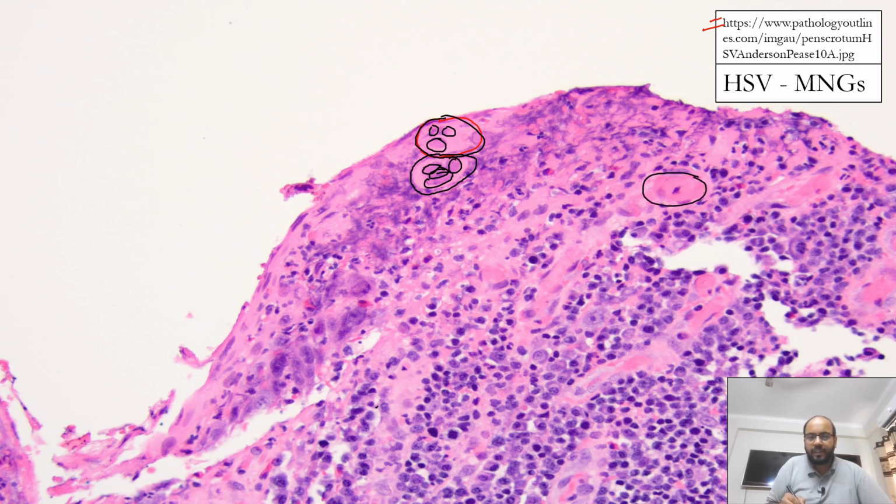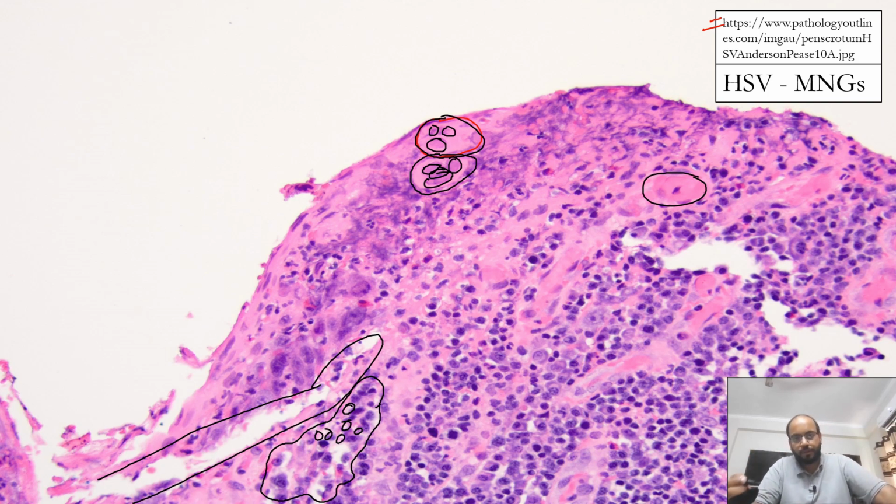A little bit of ballooning degeneration is observed here. Can you see a spongiosis-like picture? It is showing some localized spongiosis. And when you look closely, you see that some of the cells have empty spaces in between because they are undergoing ballooning degeneration. And if the degeneration is vast, it will lead to a split like this, an intra-epidermal split because of ballooning degeneration seen in virally infected cells. Let's move forward.